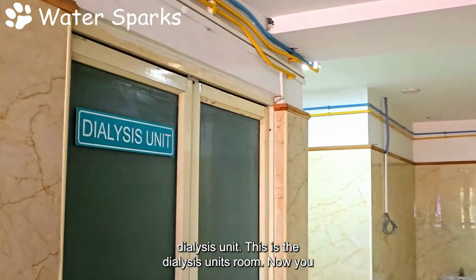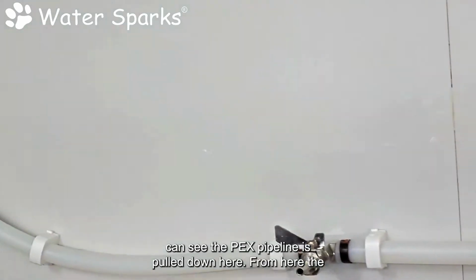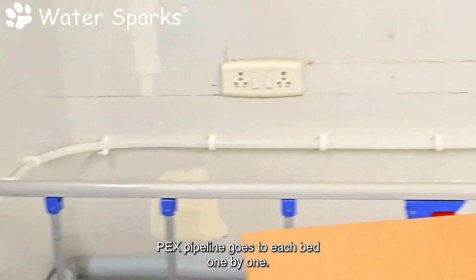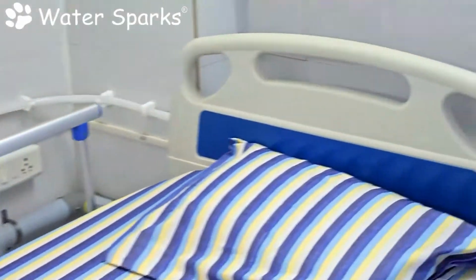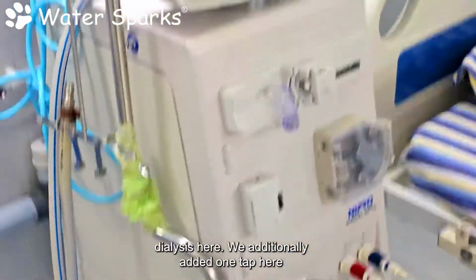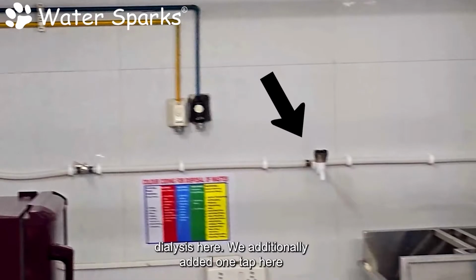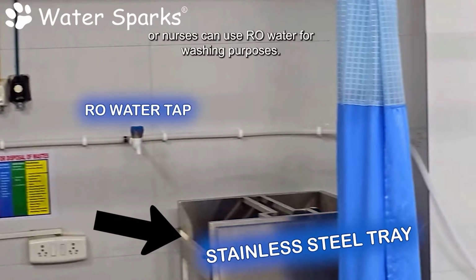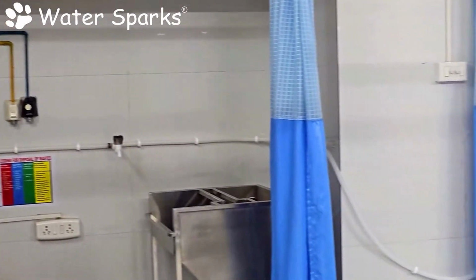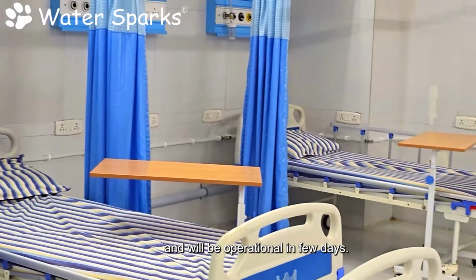This is the dialysis unit's room. Now you can see the PEX pipeline is pulled down here. From here, the PEX pipeline goes to each bed one by one. For each bed we have given one outlet line for the patient's dialysis. We additionally added one tap here, so doctors or nurses can use RO water for washing purposes. The hospital is new and work is in progress, and it will be operational in a few days.